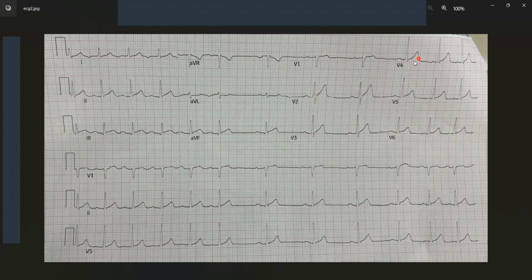If we look at the anterior aspect, we do see a slight ST elevation also in V2. You can even see it in V1. In V3, it's not as prominent. It's more of a high takeoff. Let's try to annotate this and draw a line over there. I don't think it will allow me to do a line. All right, not allowing me to do a line.